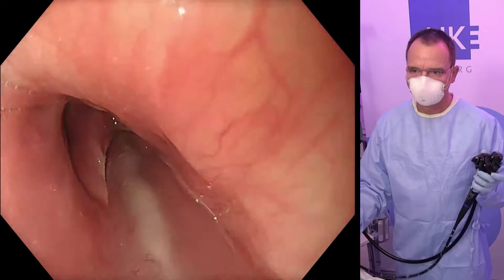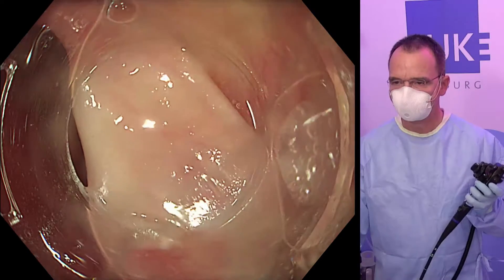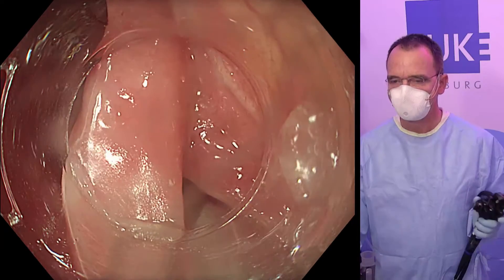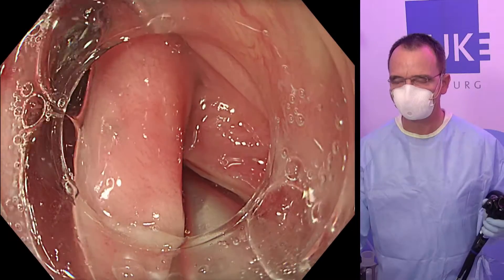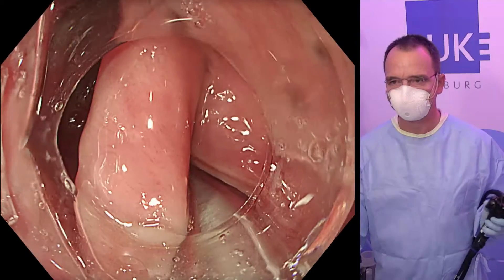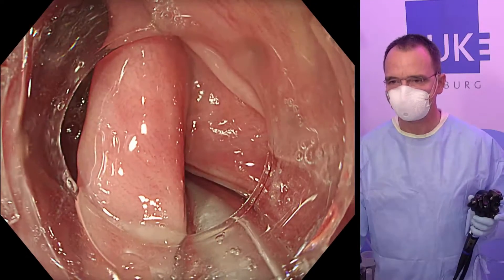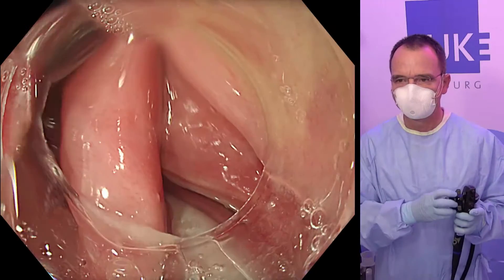Here you see the septum on the left side. We will be using a conical cap. This is the septum. We are also using the new Olympus 1500 gastroscope.